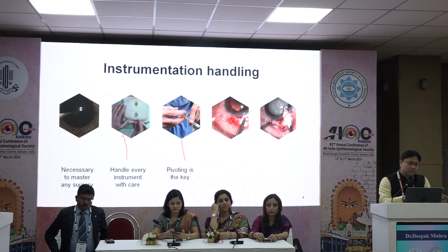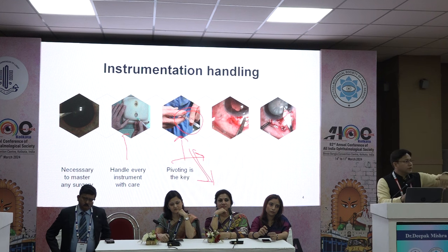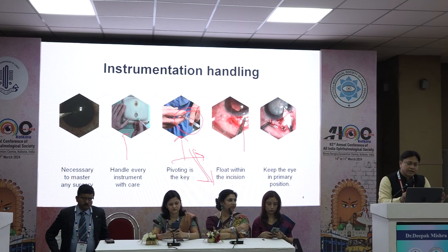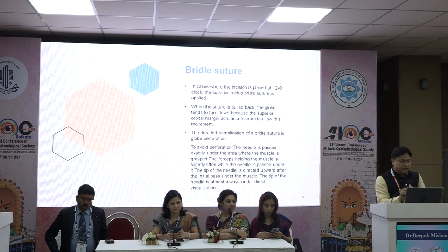And again, instrument holding also includes the direction. Like here you have seen someone injecting visco horizontally. It is slightly more troublesome to inject high viscosity material against gravity. If you use your syringe tip pointing downward, then you will find how easy it is to go there. And again, for making a flap, when you are working on the cornea, at least see which area you are seeing and what area you are going to cover and hold. In one of the surgeries, although we are giving a block, we still need support for the other side. So holding of the instrument means these four or five things.